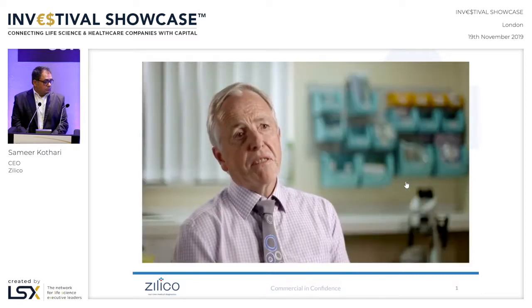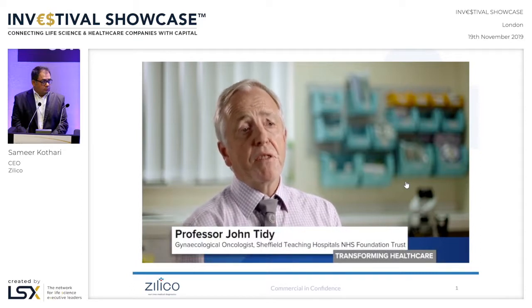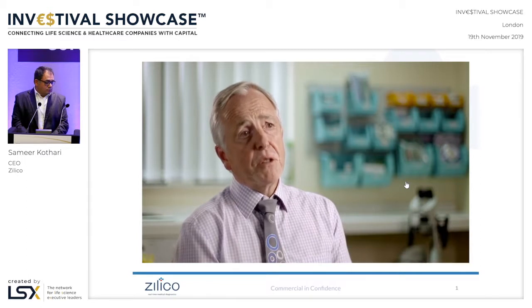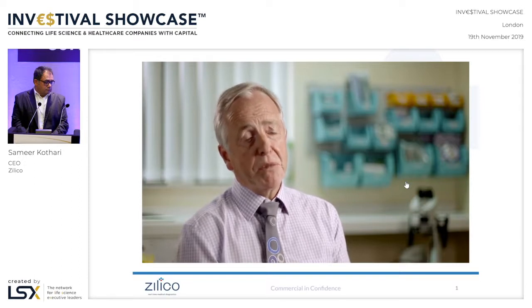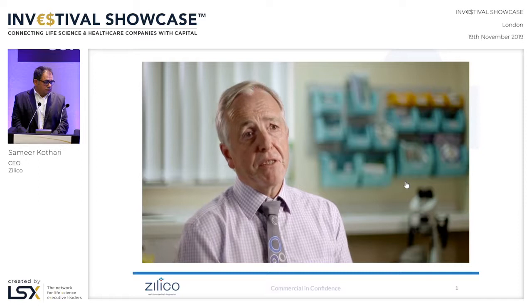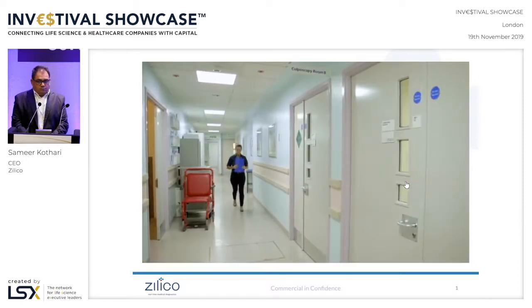Well, I think as a colposcopist, if you have a second real-time test available to you, then it improves your confidence in deciding how to manage somebody. So if you're seeing a patient and you think there might be disease there, it will give you a better indication of where to take a biopsy. That means that we're detecting more disease and reassuring patients who don't have disease. That has led to us taking fewer biopsies overall.